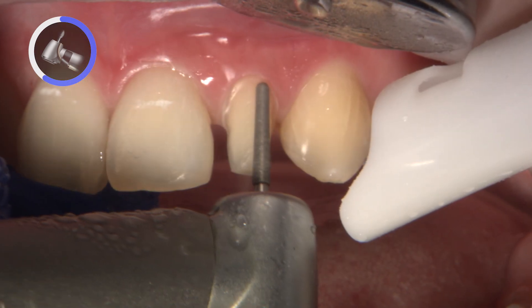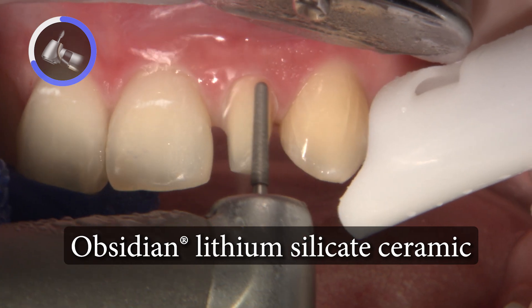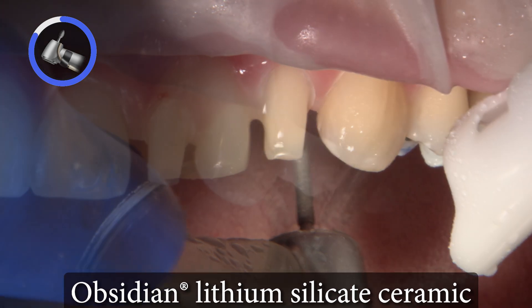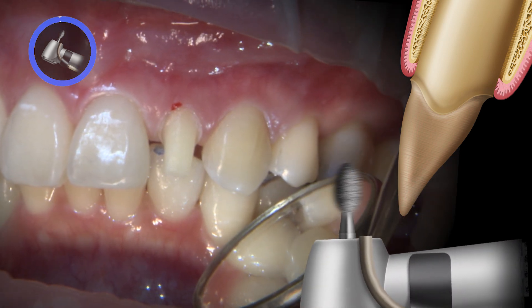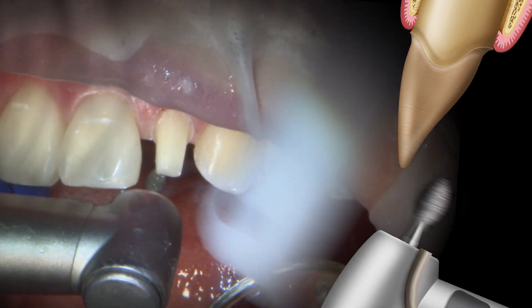To fix the baby tooth appearance of number 10, I decided that Obsidian All Ceramic would be the most suitable material to satisfy the patient's need for a full coverage crown with life-like aesthetics. Using long tapered round-ended and football diamond burrs, I prepare the tooth equigingivally with a 0.5 chamfer margin to provide enough material thickness and strength.